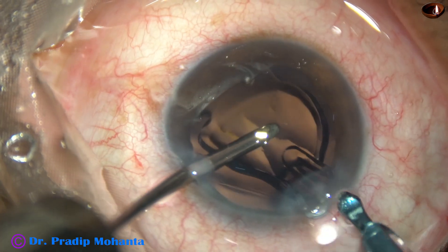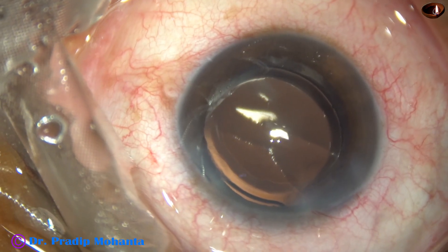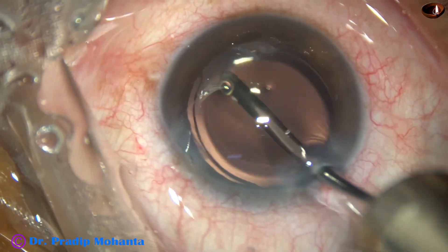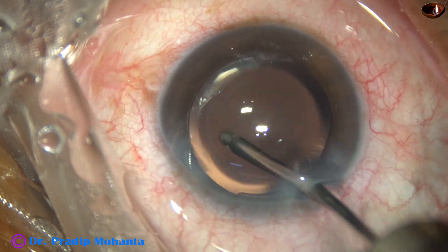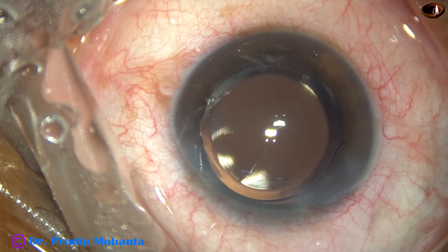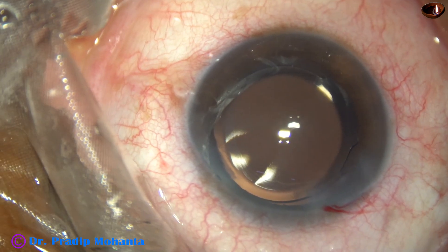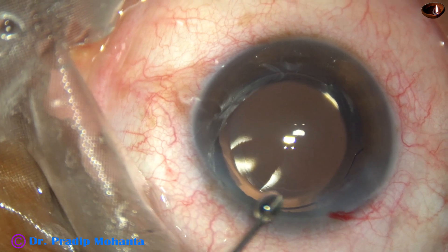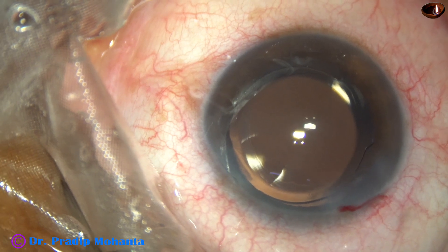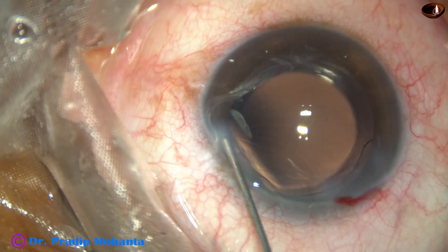Hydro-implantation of a single-piece monofocal intraocular lens has been done, but beginners should use viscoelastic to fill up the anterior chamber and capsular bag before implanting the IOL. Since we have not used viscoelastic in this case, we save about two minutes of time, because thorough removal of viscoelastic takes about one and a half to two minutes.